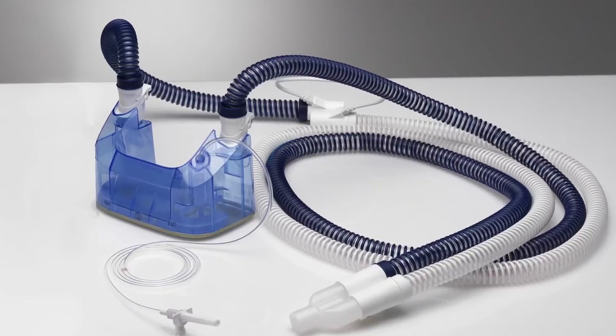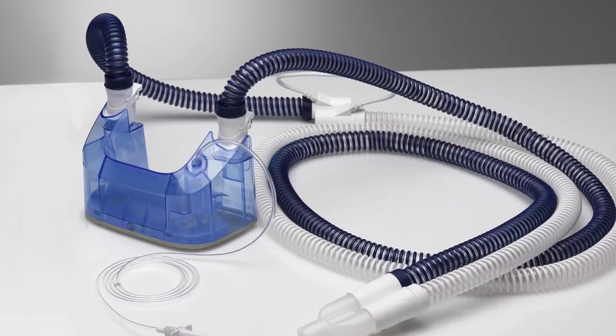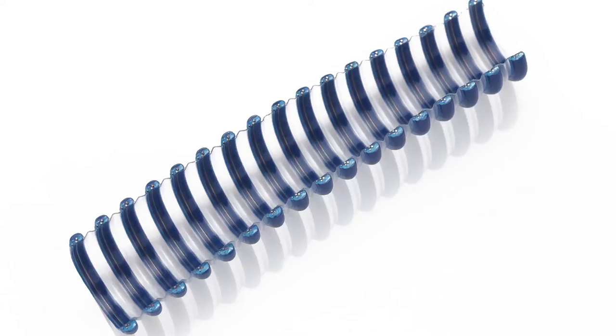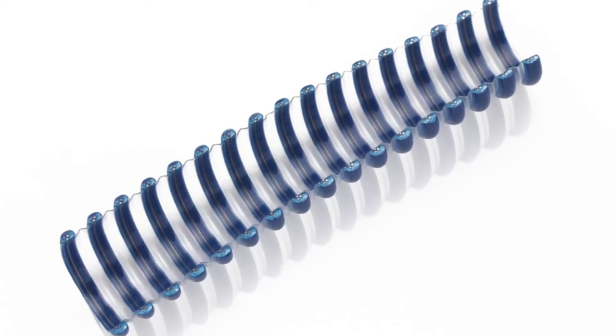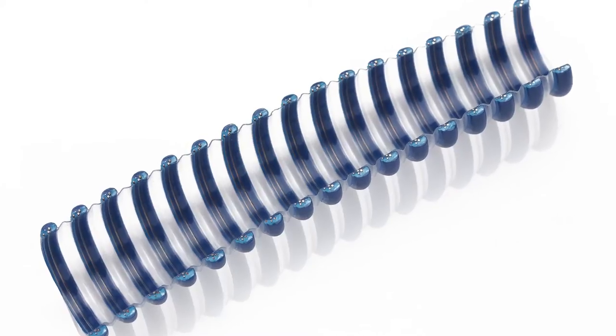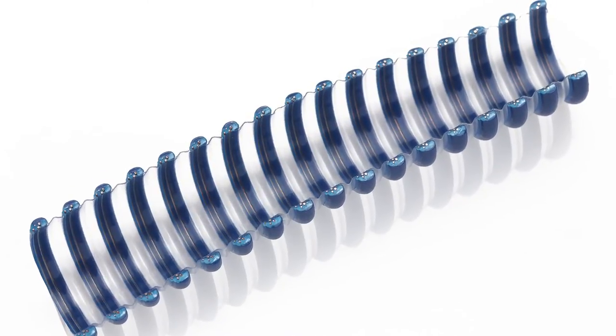Rain out in the Hamilton H900 breathing circuit is visibly lower than in other products. This is because the heater wires are integrated directly into the circuit wall, eliminating the cold surface between the heated breathing gas and the ambient temperature.